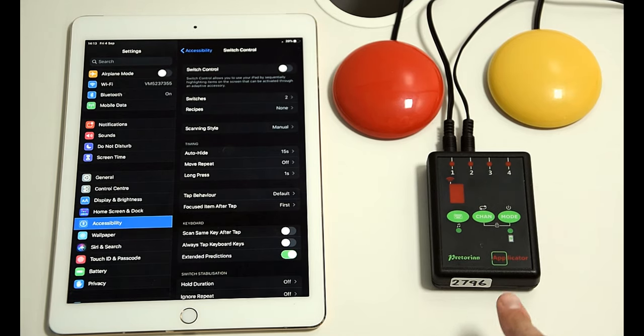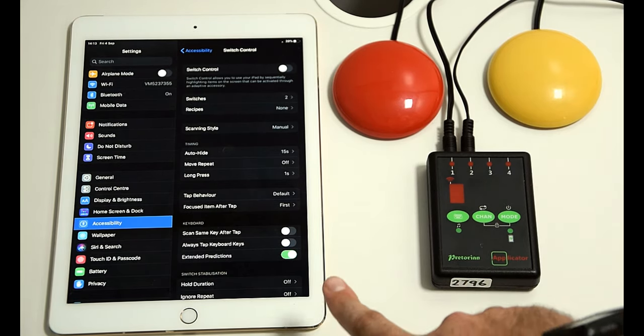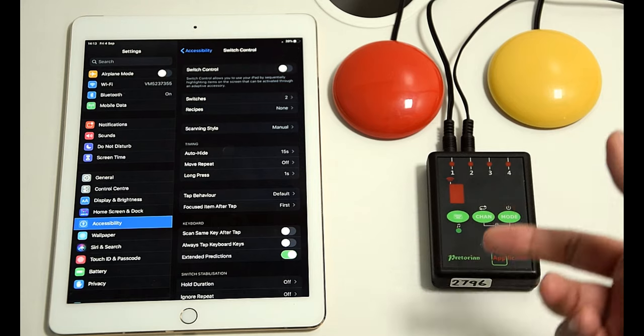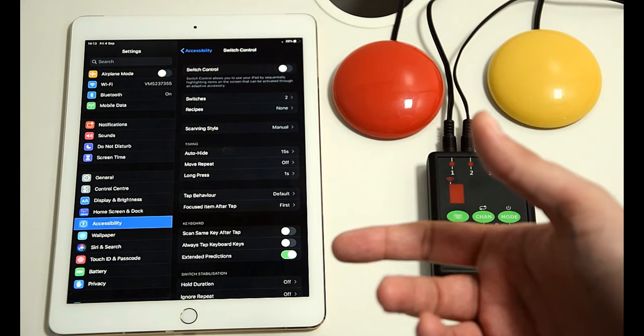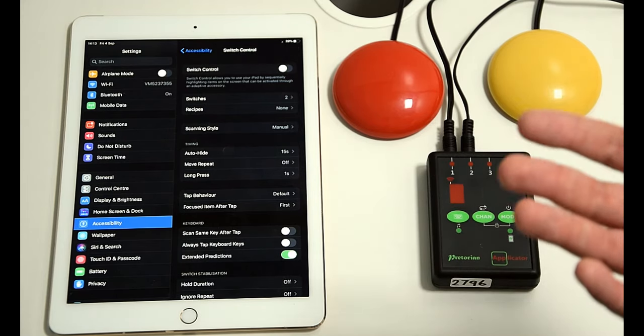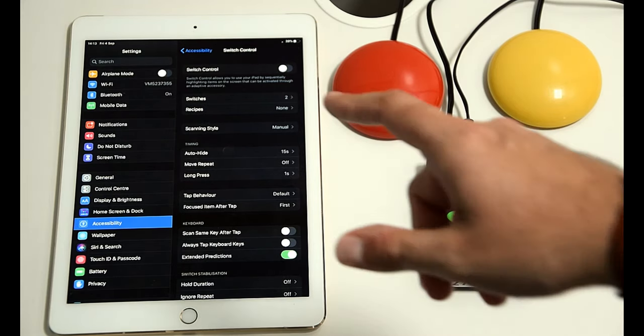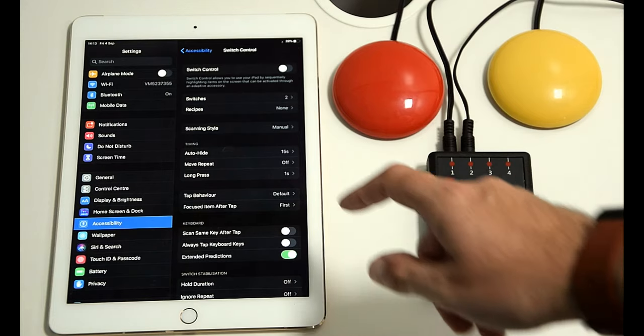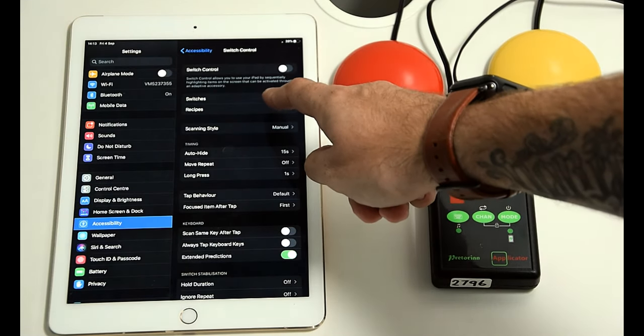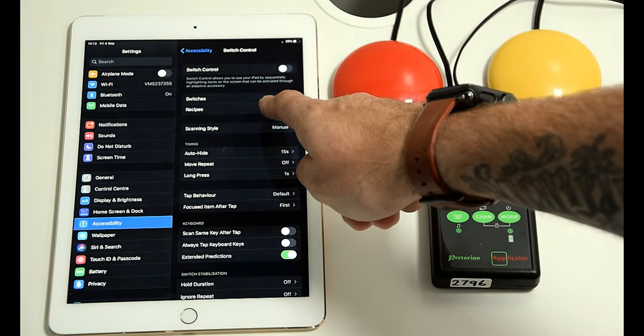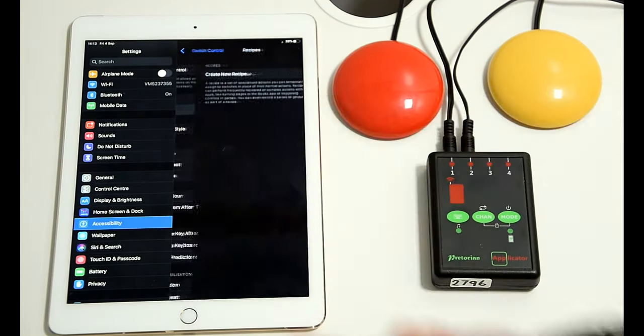So the Applicator's turned on, we are paired up, the switches are still connected, but it doesn't matter what function they're set up at because the recipes will override that completely. So you're in switch control menu in accessibility and you go to recipes.